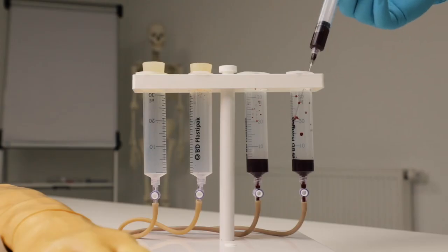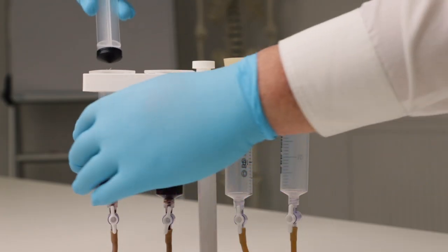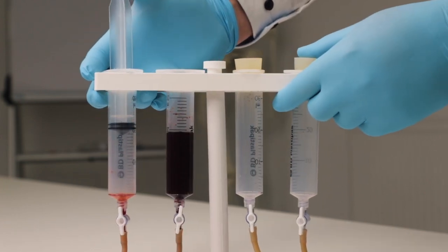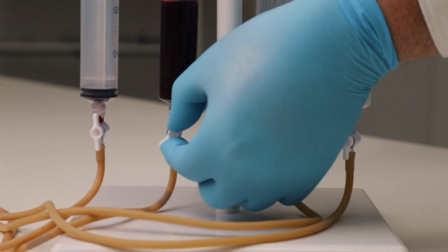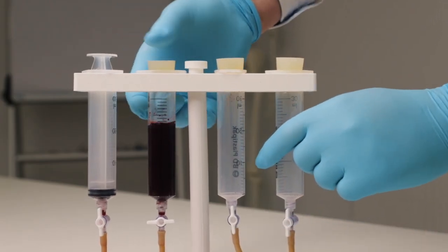Do not forget to fill the blood taken from the arm back into the tubes. If you take a longer break from the training, please empty the vein tubes. To do so, press the piston into one syringe and push the blood into the other one and then close the stopcock. If you like, you may close the syringe with a supply plug.